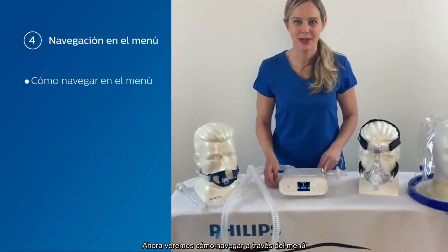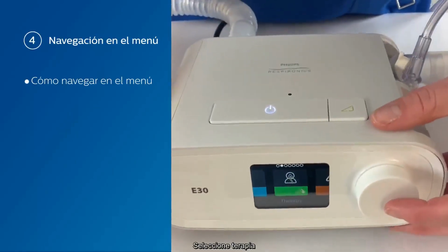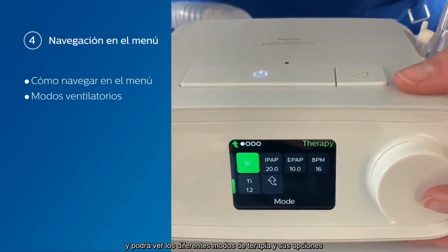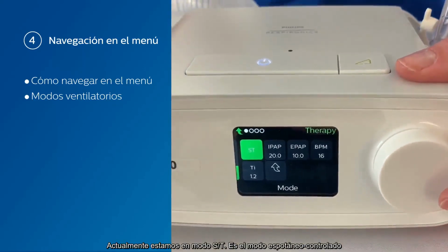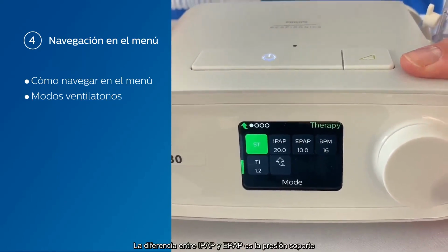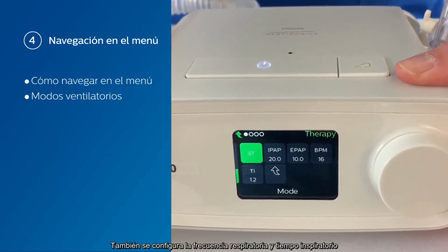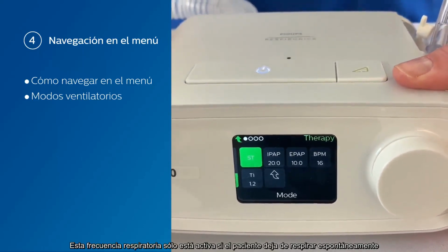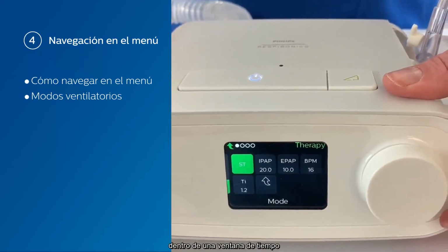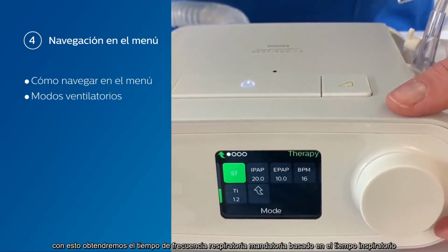Now we're going to go through how to navigate the menu. Use the control dial, select therapy, and you can see all of your different therapy modes and options. Currently, we're on ST mode. This is a spontaneous timed mode where you set an IPAP and an EPAP. The difference between IPAP and EPAP is your pressure support. You also set a breath rate and an inspiratory time. This breath rate is only active if the patient ceases to breathe spontaneously within the time window. Then they will get a timed or a mandatory breath based on the inspiratory time.